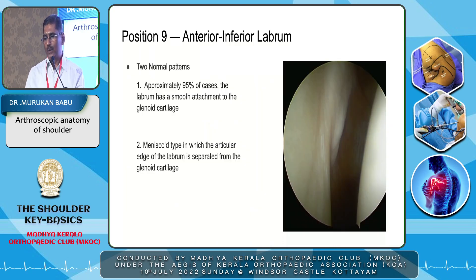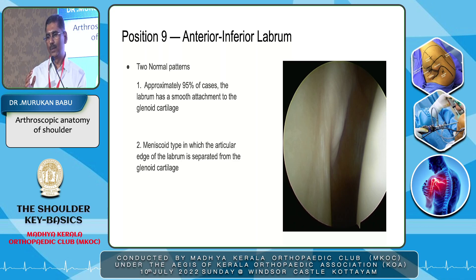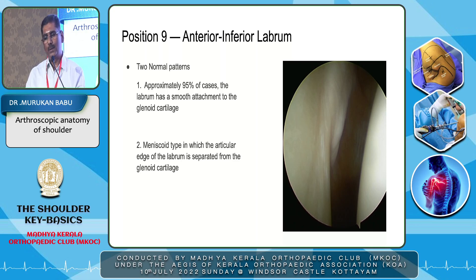Coming to the ninth position — the anteroinferior labrum. From the superior glenohumeral ligament, middle glenohumeral ligament, subscapularis tendon, and anterior superior labrum, you come to the ninth position: the anteroinferior labrum. There are two normal patterns. Approximately 95 percent of cases the labrum has a smooth attachment to the glenoid cartilage, and sometimes it may be meniscoid where the edge of the labrum is separated from the glenoid cartilage.